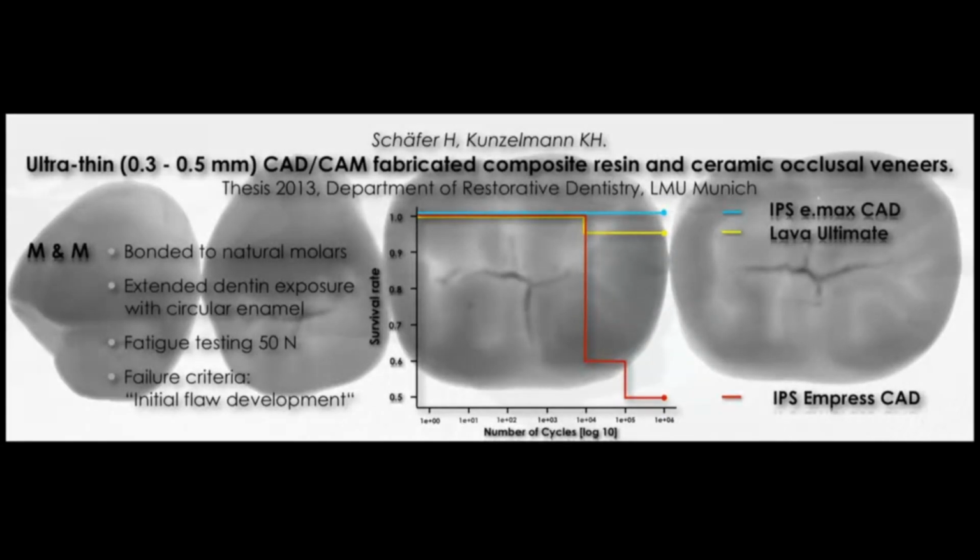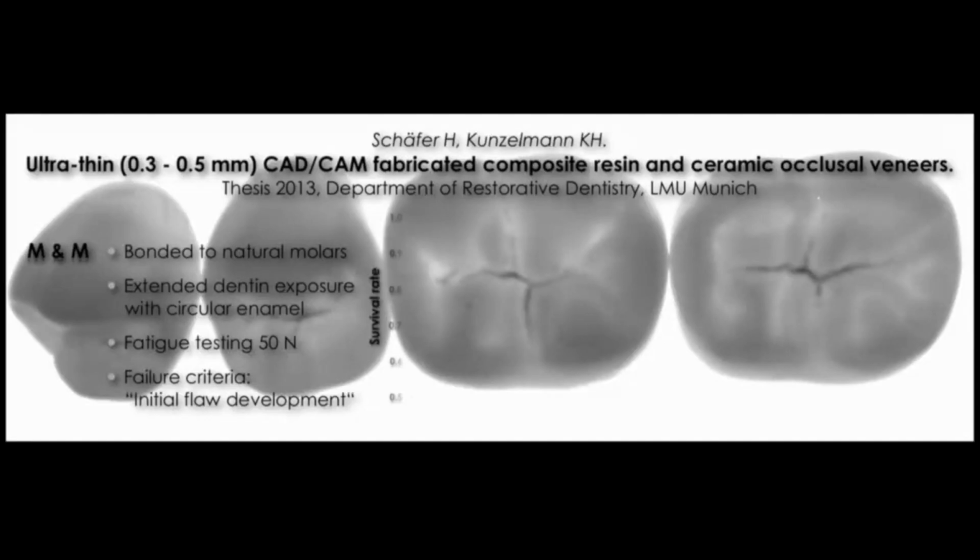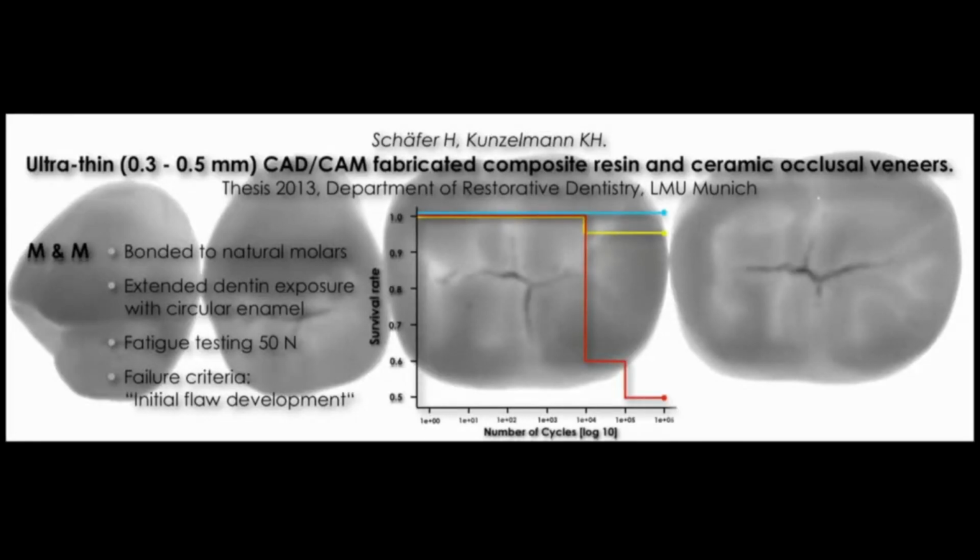So what is the new trend? I go back again. What is the new trend? We see in all the different universities now a search for thinner restorations. We do some research, especially Karl-Heinz Kunzelmann, and this is the thesis of one of his students. We did some research in our dental school, and we have seen that you can thin out even E.max CAD or E.max Press as well.